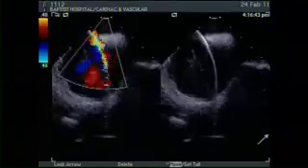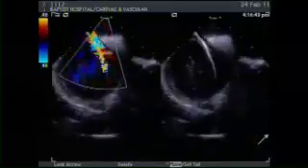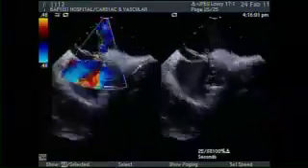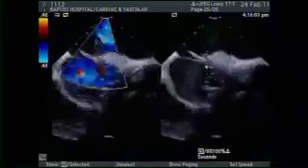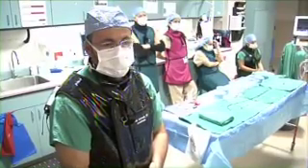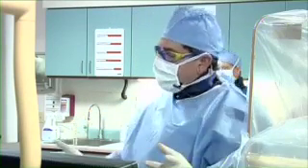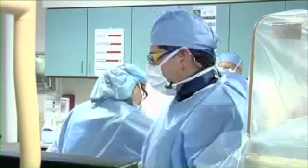Ralph, do you want to comment on the echo that we saw with the balloon? Well, what Dr. Quesada has done is he's inflated the balloon to the point where the color flow stops. And once the flow stops, that balloon is filling the tunnel, giving us clear images of what that tunnel really looks like, how wide it is, how long it is, and we're able to judge what type of device as well as how large a device needs to be placed. So now we have an idea. We think that the device is about 10 millimeters. And we're going to choose different devices to close it.